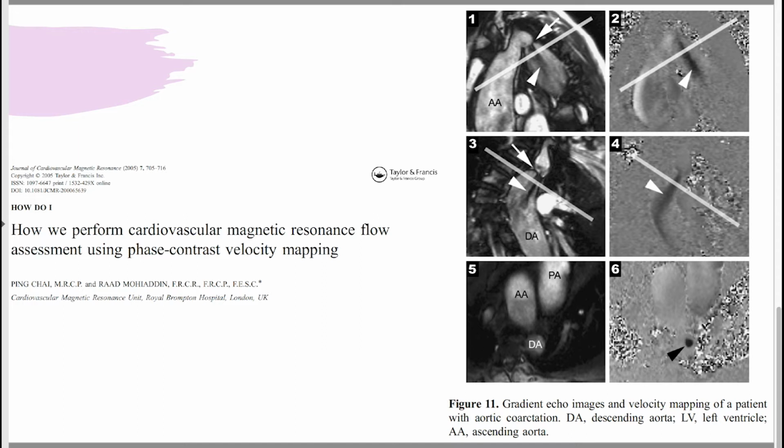CMR is used for assessment before and after intervention. It can delineate anatomy and provide information on severity through quantification of peak velocity at the obstruction site.